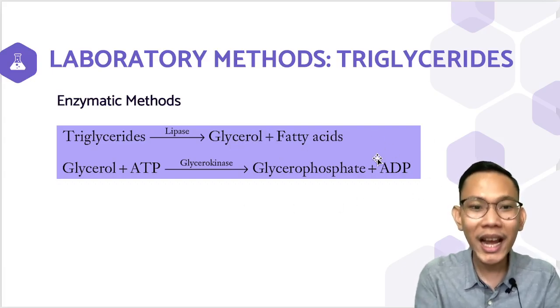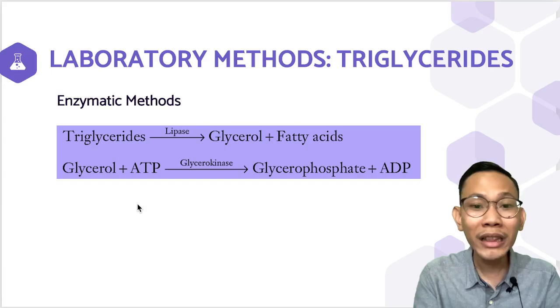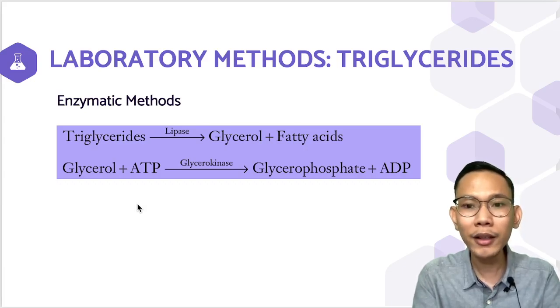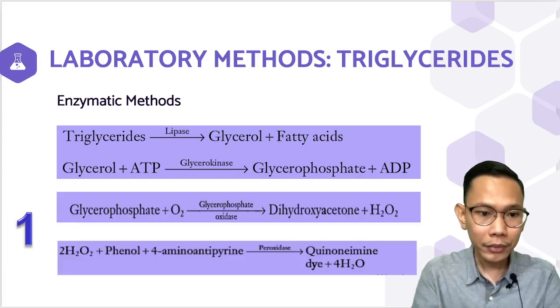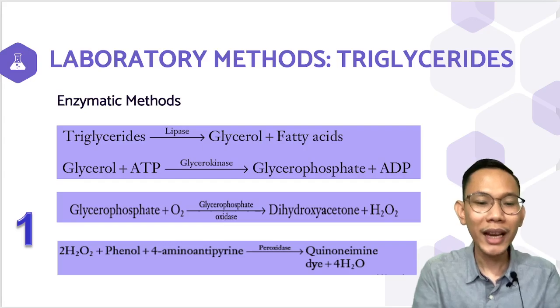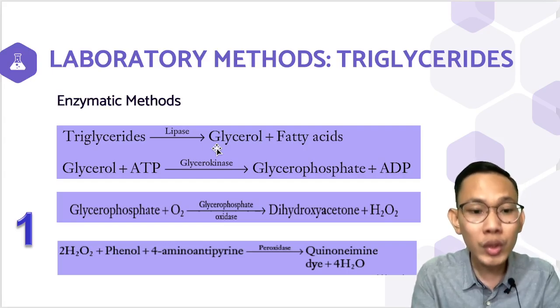I hope this is very clear, ha? Again, these are the two most common steps, or the first two steps, of the different enzymatic methods for your triglycerides. Now, we will first discuss the first method. So, again, the first two steps are the same lamang. The first method, this is now the most commonly used method.